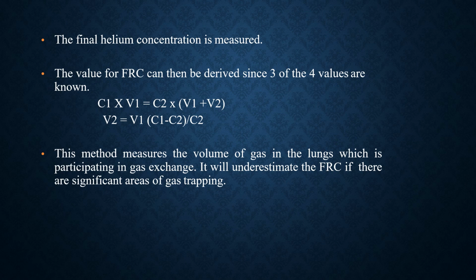So this method measures the volume of gas in the lungs which is participating in gas exchange. It will underestimate the FRC if there are significant areas of gas trapping.